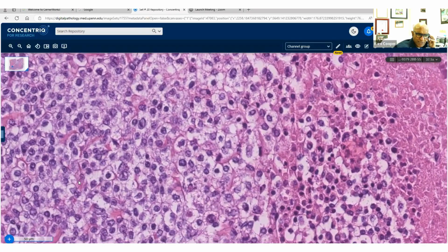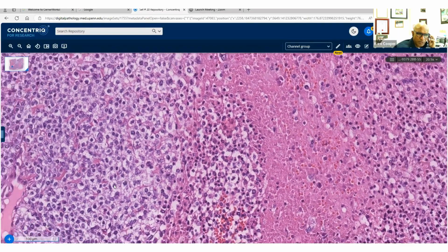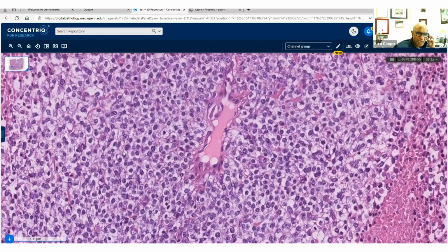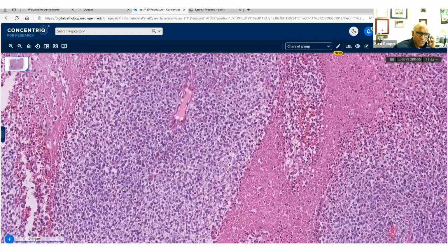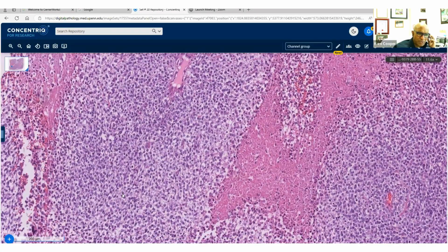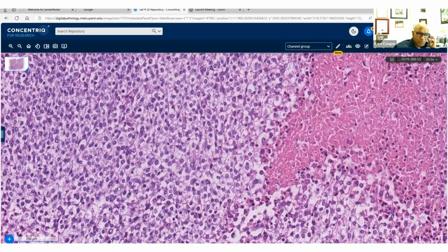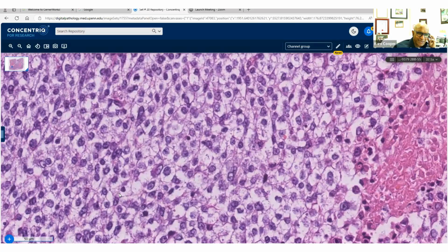But some of the other tumors that I've seen with this particular group have shown more pleomorphism. So Ewing's has to be that. Let me hasten to add that the CD99 in this case was variable, patchy, not something that engenders a good feeling for Ewing's. So it was not the diffuse CD99.